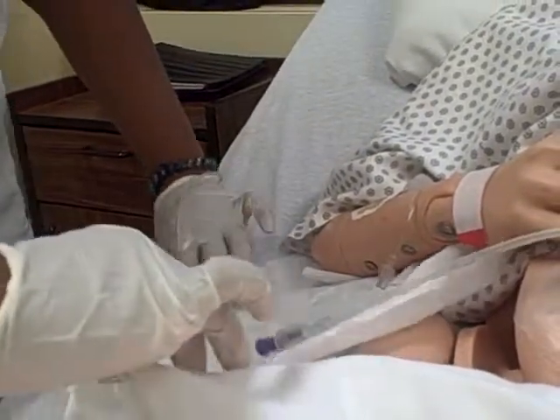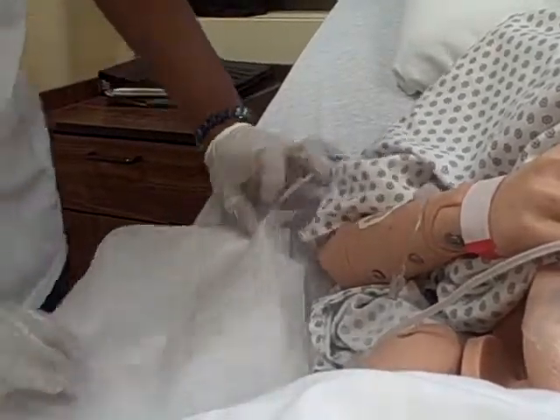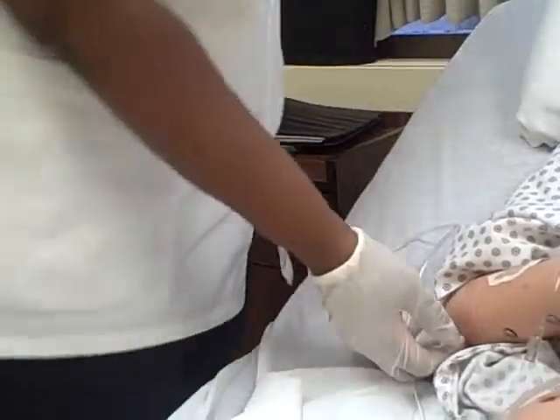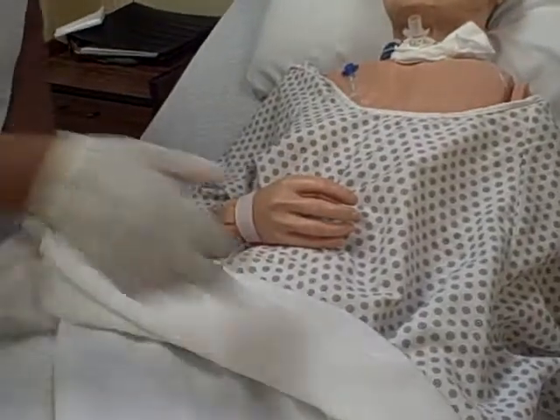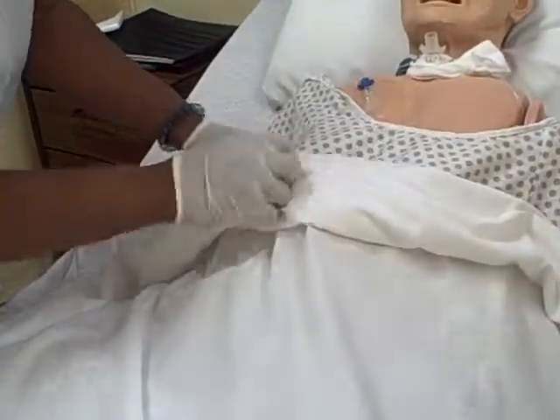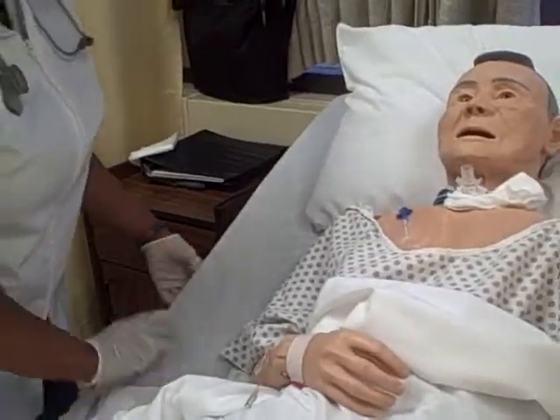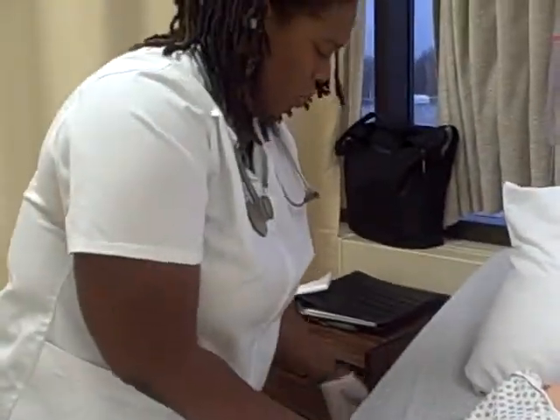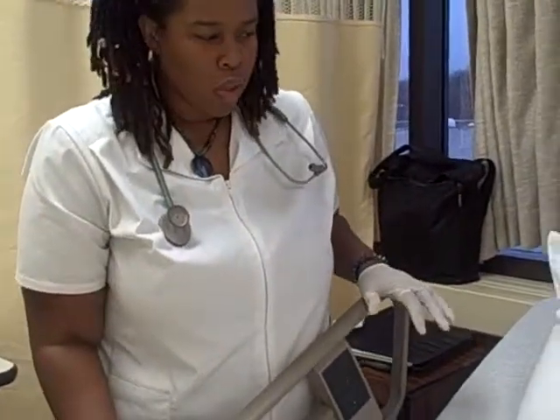I'm going to clean up the area, removing the protective pad and discarding this. I'm going to make sure that the patient is comfortable, maintaining patient privacy. I want to leave the call bell within reach of the patient. Put up the side rails. Lower the bed to the lowest position.